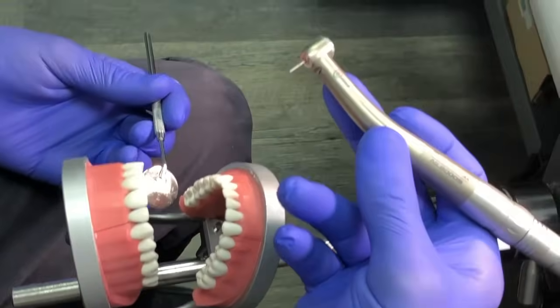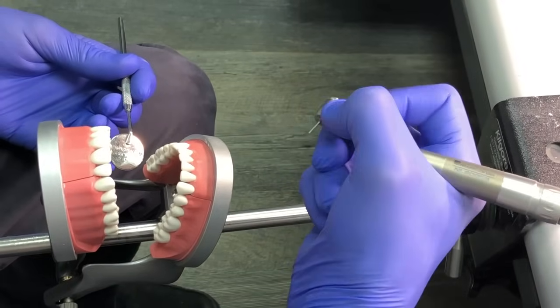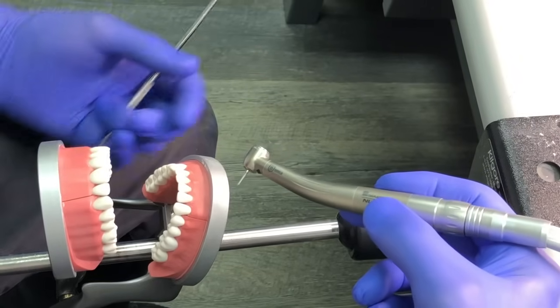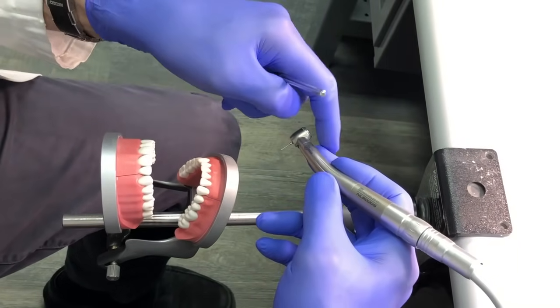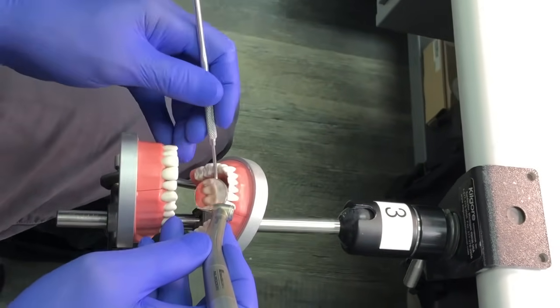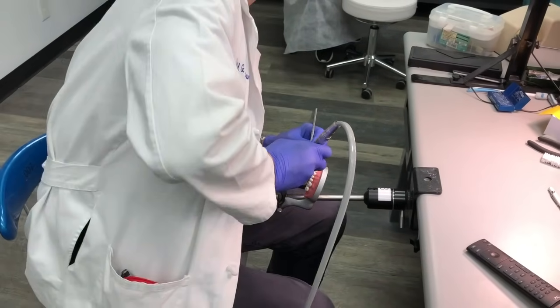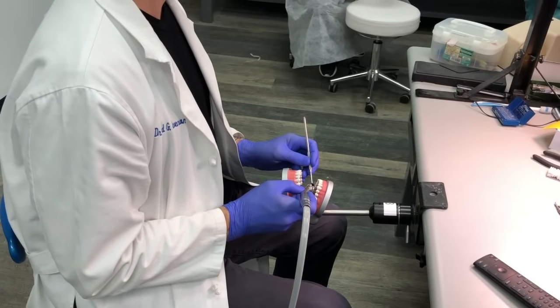I'm using a modified pen grasp here. Don't grab the handpiece like you're holding a crayon — that's not good hand control. You want your hand braced, with the thumb pushing up against the middle and index fingers. That leaves the fourth and fifth digits to help stabilize your position. I'm using finger rests with both the mirror and the handpiece — everything is stabilized. My elbows are tucked in tight, I'm sitting upright, giving me a nice controlled arc from left to right.